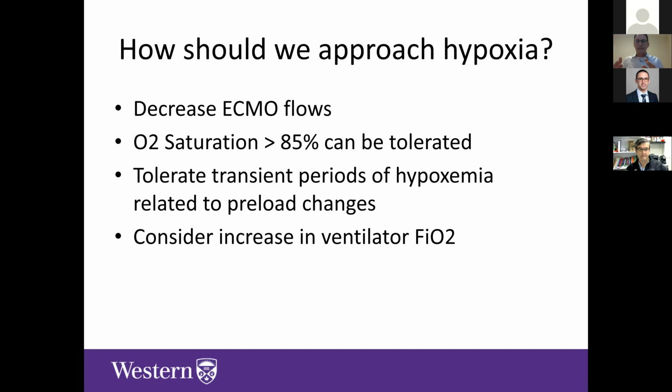If you're sucking less, then you're going to be less prone to having suck downs, which create these catastrophic scenarios where the machine's screaming, the monitor's screaming, and it turns something that's mundane into an exciting moment. So that's one strategy. The other is to tolerate transient periods of hypoxemia. And we know that's safe. It's uncomfortable to look at, but it's safe and it promotes avoiding dumping volume and sedatives and paralysis in to treat this problem. But then the other thing that you'll see as the lungs start to recover is maybe having a little bit more FiO2, that's still at a safe level, but will oxygenate some of that shunting blood.